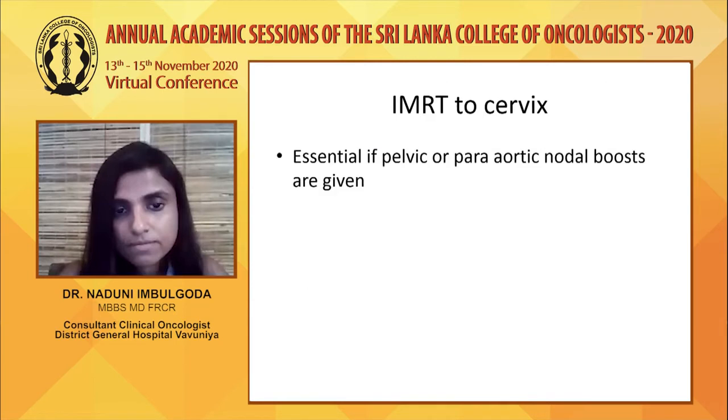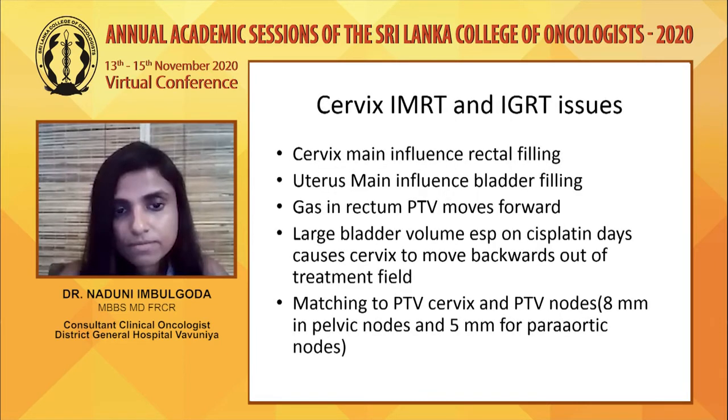And IMRT to the cervix, which is essential if you are giving pelvic or para-aortic nodal boosts. The challenges for IMRT and IGRT of the cervix include: the main influence for cervix movement is rectal filling, and the main influence for uterus movement is bladder filling. And if there is gas in the rectum, the PTV moves forward.